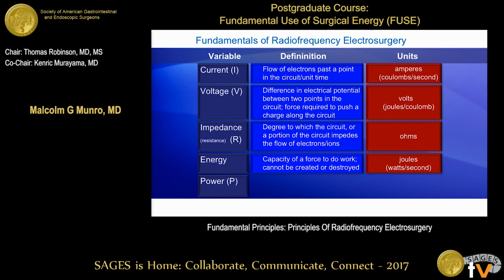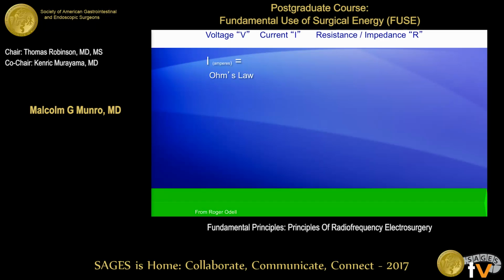And we'll explain these things. Energy is measured in joules, and it can't be discussed without knowing about power. Power is the product of voltage and current, and it is the amount of energy delivered per unit time. So how do we relate these?